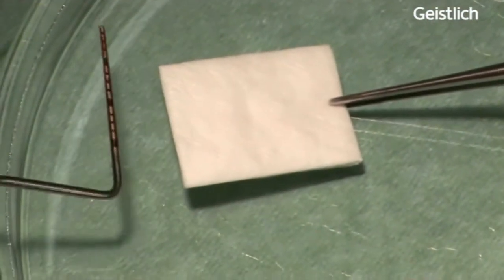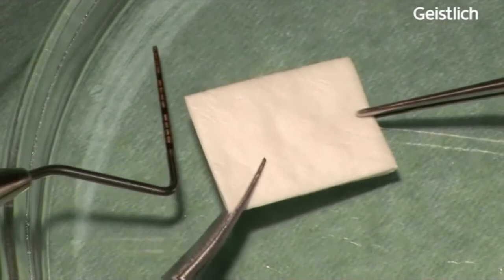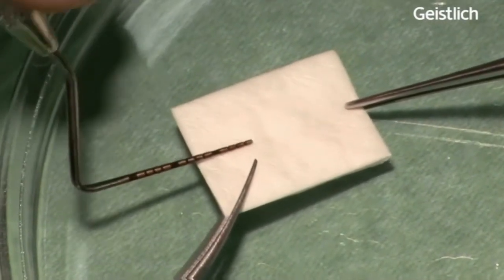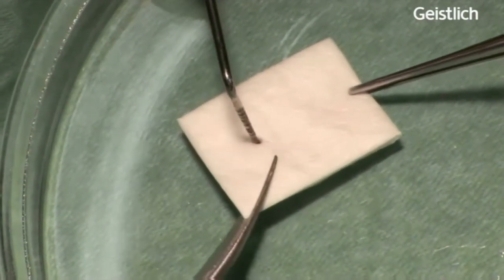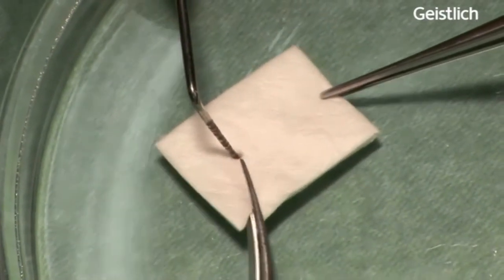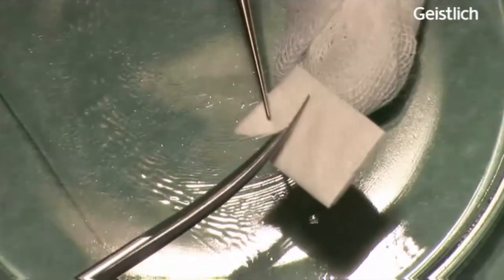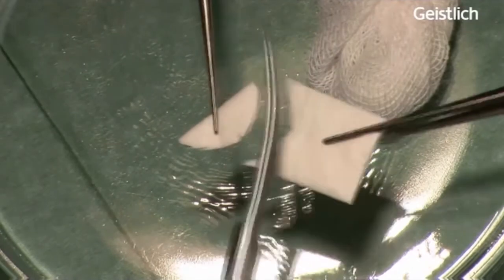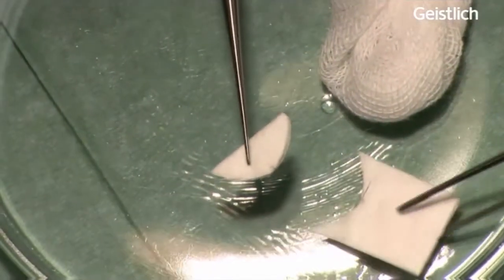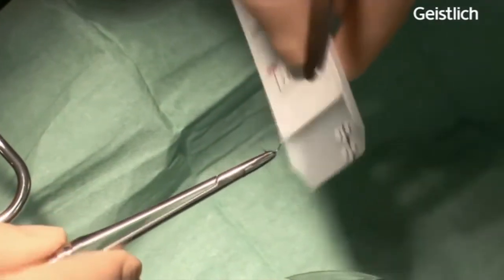Using this surgical technique we are expecting to obtain a clinically sufficient width of newly formed keratinized gingiva. It is also expected to achieve an aesthetic outcome, less patient morbidity and less costs compared to the treatment with a free connective tissue graft.